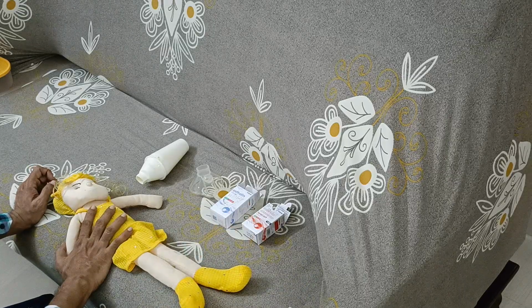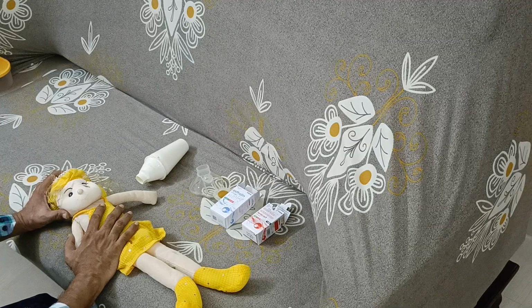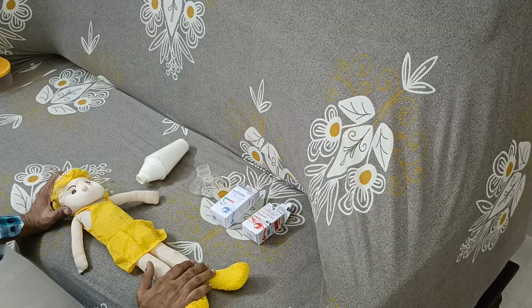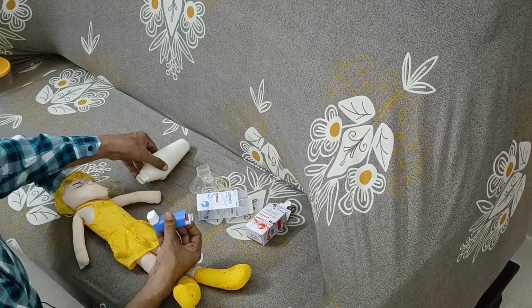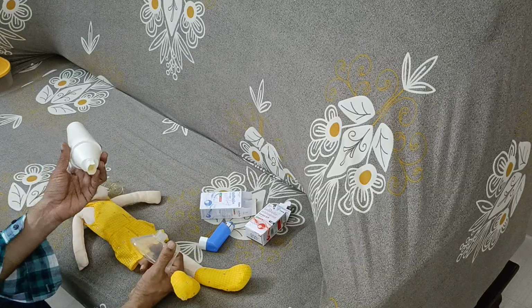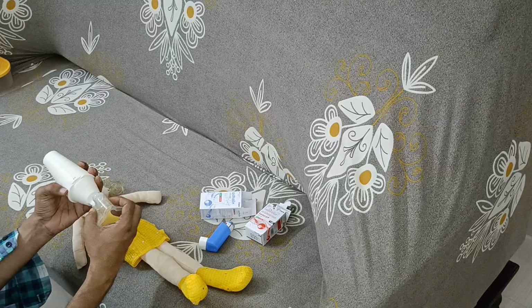Now I have a mannequin over here. It's a baby mannequin. In fact, you will be getting either a child mannequin or a baby mannequin. So how are you going to approach the patient? Initially the typical approach, I am not going to discuss everything, but how you are going to administer. Okay, so just in case of an asthma inhaler, you take the asthma inhaler, and this is the spacer, and this is the mouthpiece. What you have to do is wash your hands, but I would suggest going for a hand gel application rather than washing the hands because you don't have much time in the OSCE.